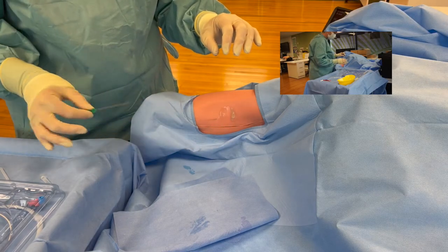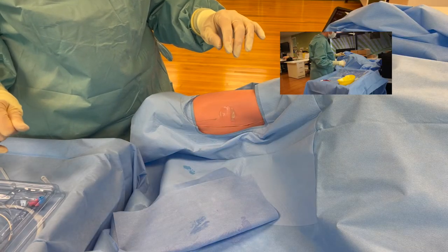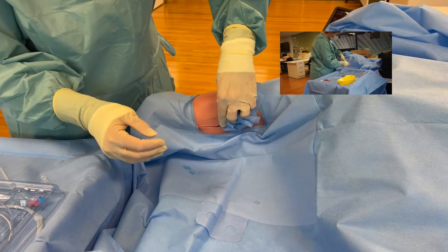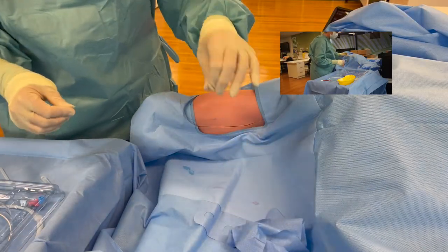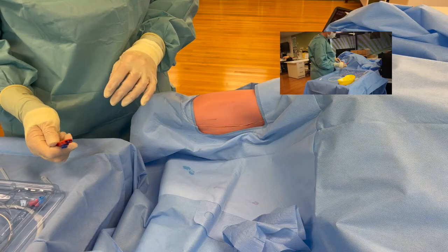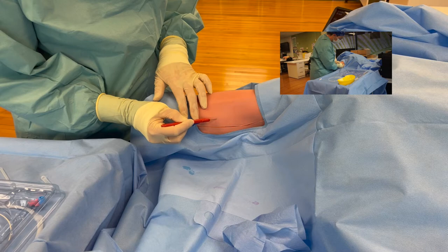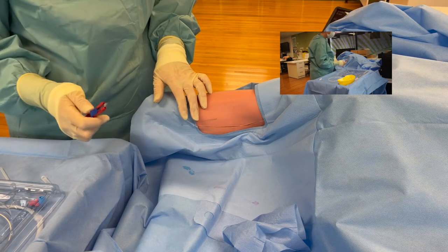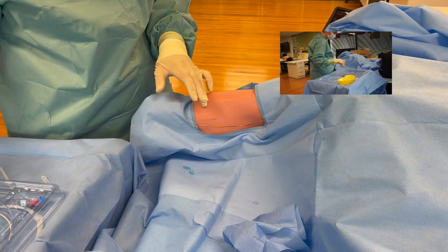We are now going to remove our needle and place it in a sharps safe zone. At this point you can wipe away your ultrasound gel because you do not need it, and it helps to keep your environment and your PICC line clean. What you do want to do is activate your scalpel blade bevel up and run it along the wire, just five or so millimeters appropriate to the depth of your vessel. Then retract the scalpel into your sharps safe zone.